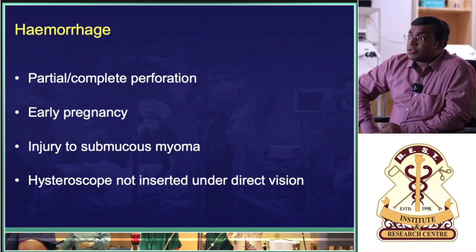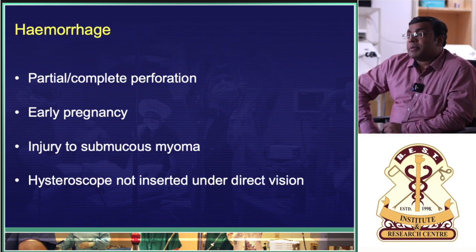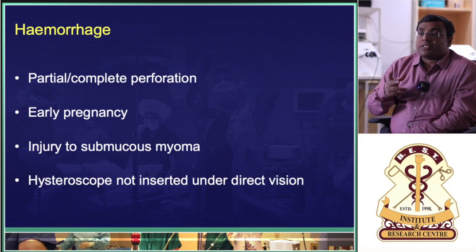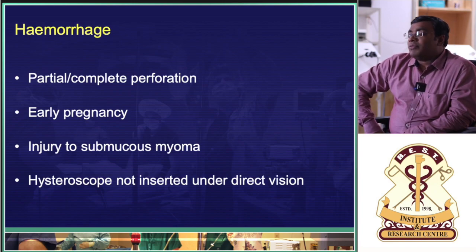Second, you have done a diagnostic hysteroscopy. Vaginal bleeding is not there much, but the patient is desaturating or developing tachycardia, going into hypotension, abdominal distension. That means intraperitoneally she is bleeding somewhere. So that is an indication. If you are using an energy source based resectoscope and when you are resecting something, perforation of the uterus happens, then you should do a diagnostic laparoscopy, not for all cases.